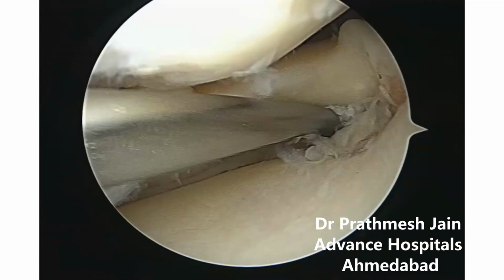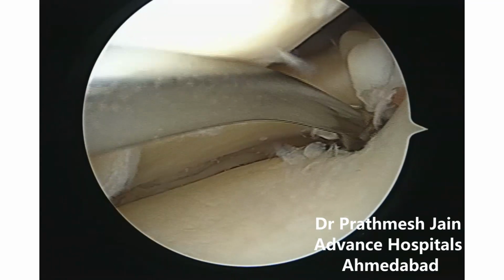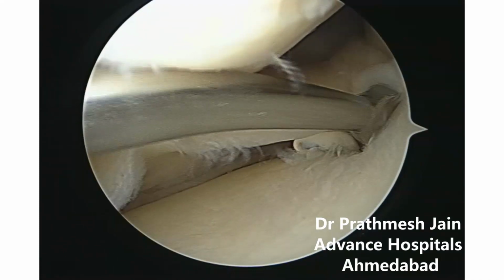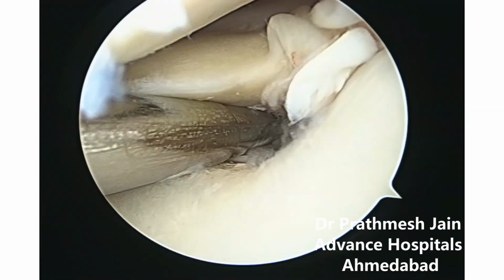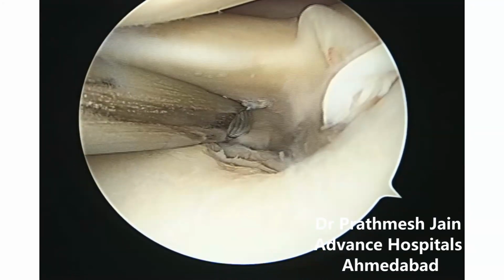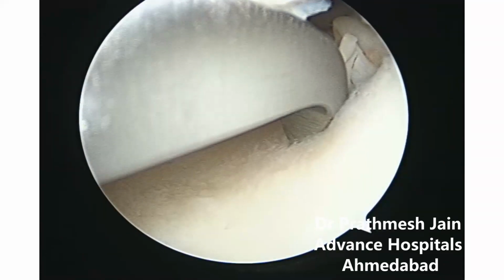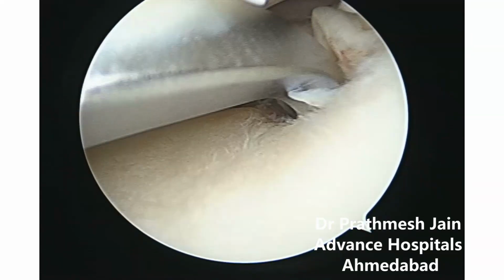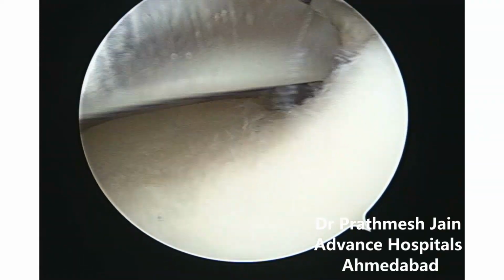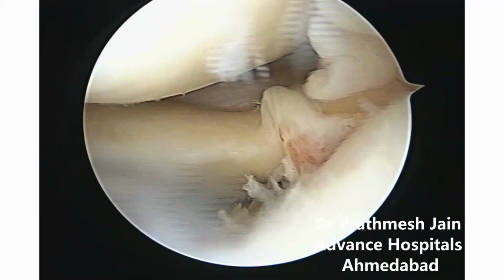We use a curette to prepare the bed of the root because we want the root to heal to its own location, its own anatomical footprint. Once we prepare it, we can clean it with the shaver, and then we can use a specific jig, the root repair jig, to pass the bead pin through the footprint. So this is the native footprint. The bead pin is passed.